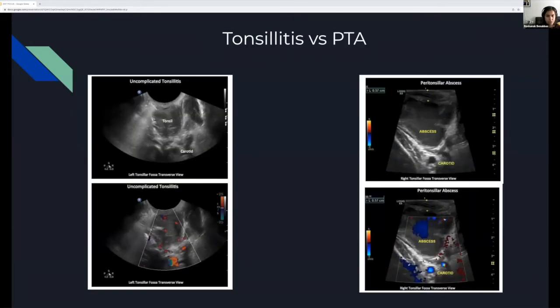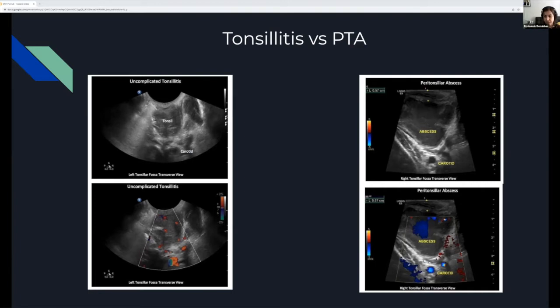Compare that to tonsillitis on the left versus a peritonsillar abscess on the right. With tonsillitis, you have a preserved structure — same characteristics as a normal tonsil, just larger. If you put color Doppler on it, you'll see increased vascularity within this big inflamed, angry-looking tonsil. As opposed to a peritonsillar abscess on the right, where you can see actual pus inside. If you move your probe around you can see the pus moving. If you put Doppler on it, you won't see vascularity within the abscess — just motion artifacts if you shake the probe.